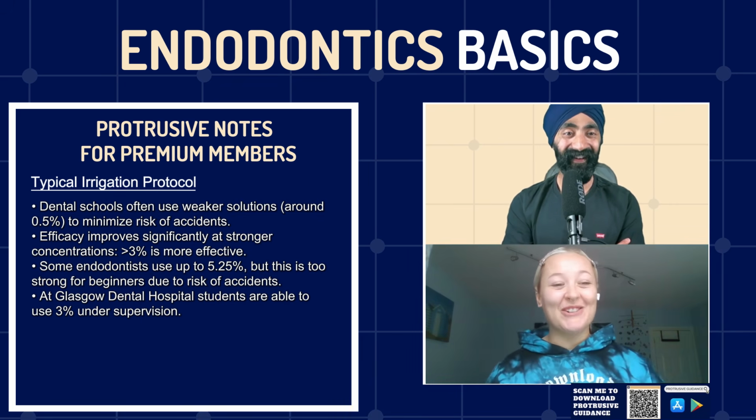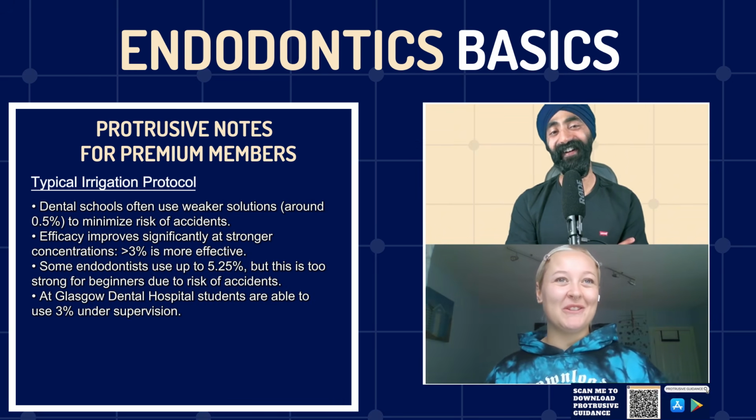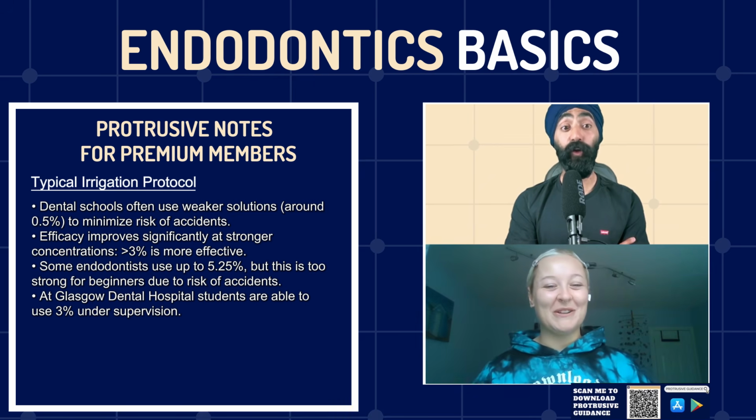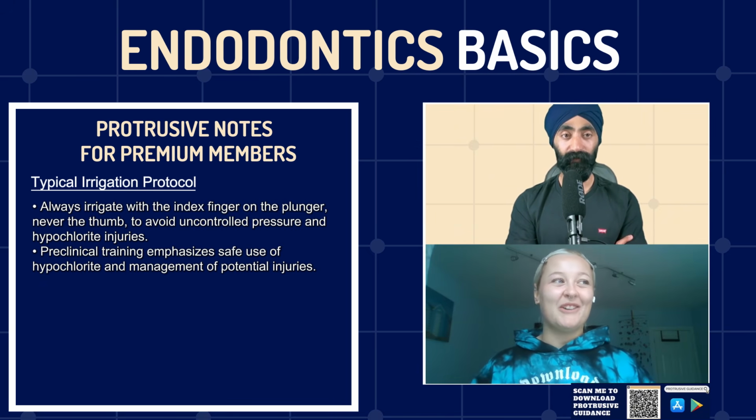No, not that I know of, not yet anyway. But if you go around with your thumb on the plunger, you'll get shouted at. Great point there. Never have your thumb on the plunger. It should be your index finger. Is that what you've been taught? Yeah, your index finger. So we'd get a row for that one.